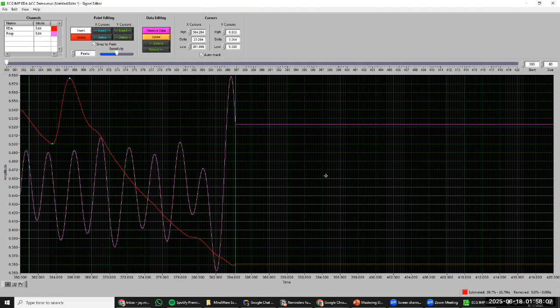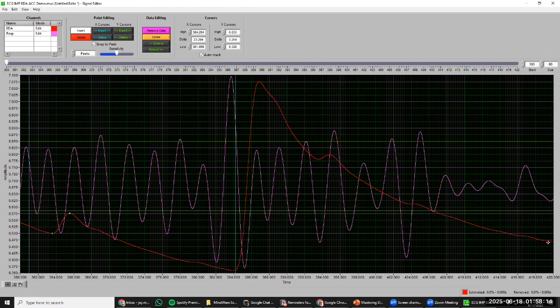Right away, a lot of people might be thinking, well, how do we know that that's the level? What about the activity that occurred? It's really not returning down to baseline. How long did that take? These are all confounds, and they're just inherent in editing the data this way. So normally we recommend staying away from that if possible, right? Because we don't know exactly what we could be doing with the data.